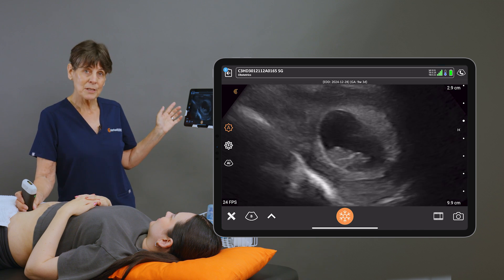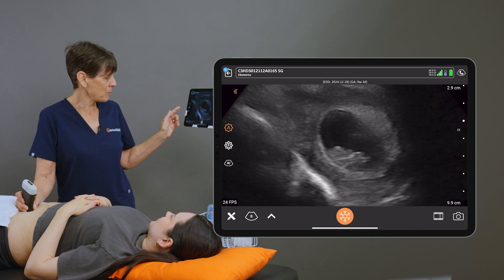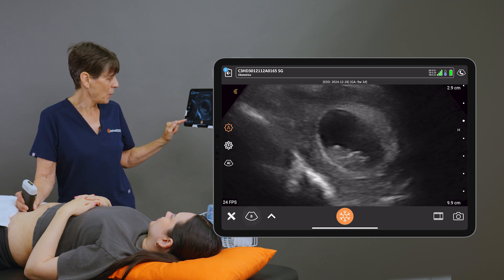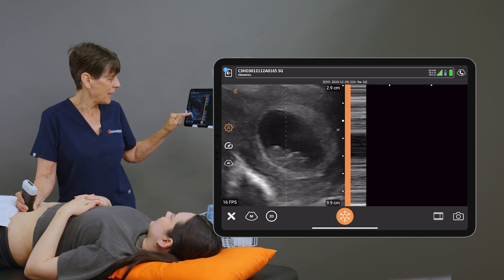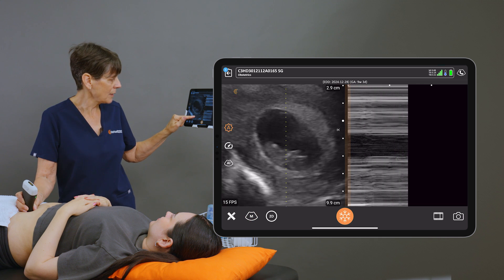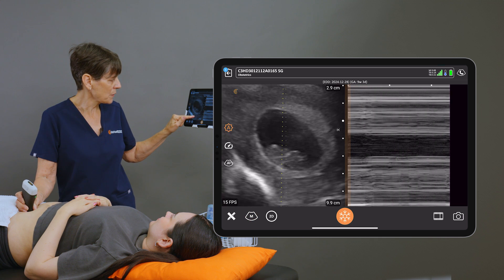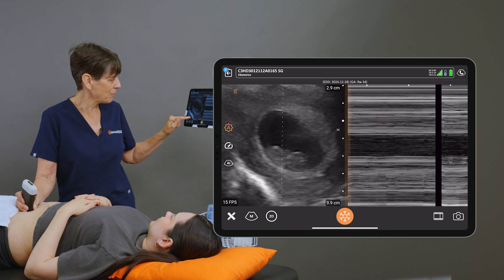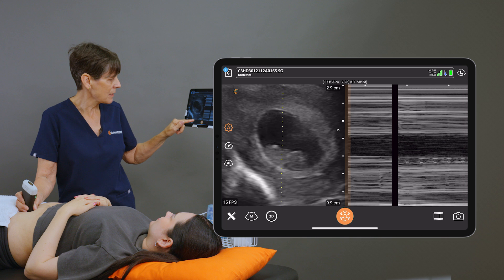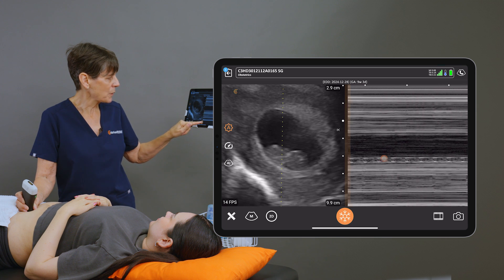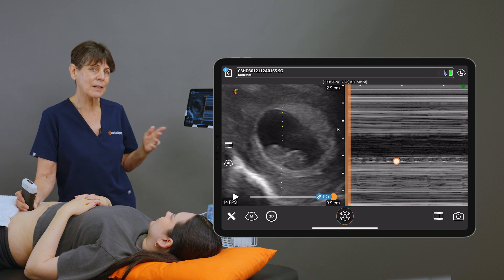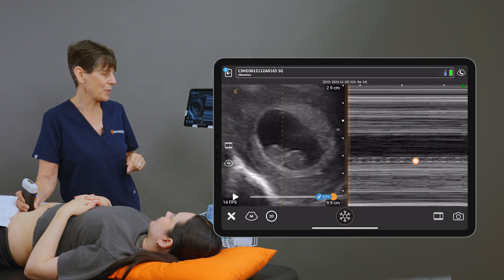In order to establish a heart rate, I'm going to go into the M-mode and place our little line right over that flickering heart. We can see on this side we're getting a little broken line on the M-mode image.